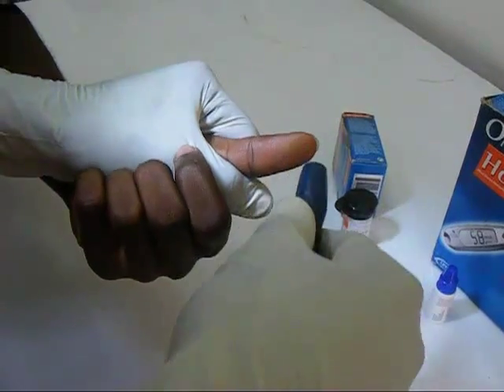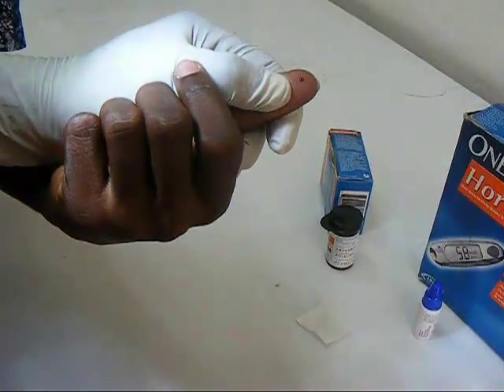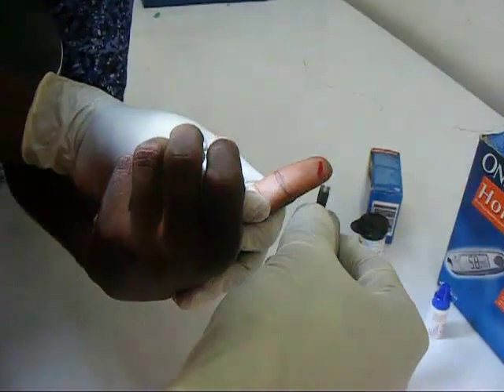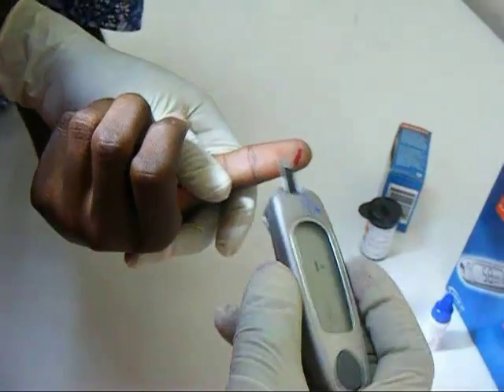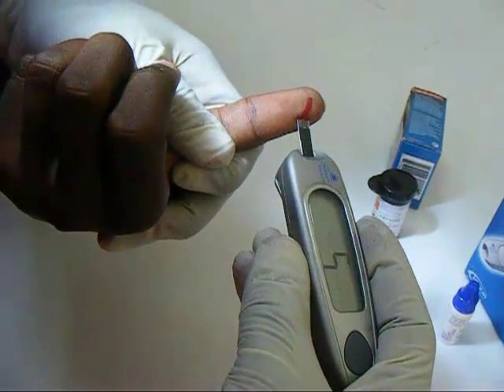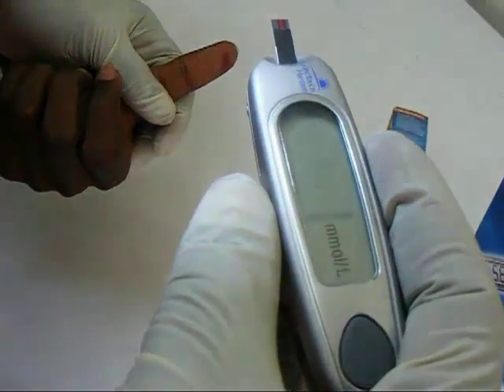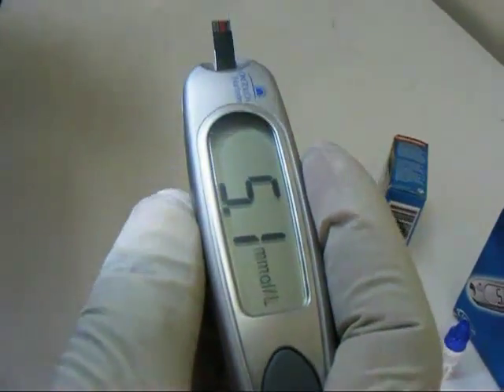The lancet is used to prick the tip of the thumb and the blood is collected with the test strip. The blood glucose concentration is then displayed on the meter after a few seconds.